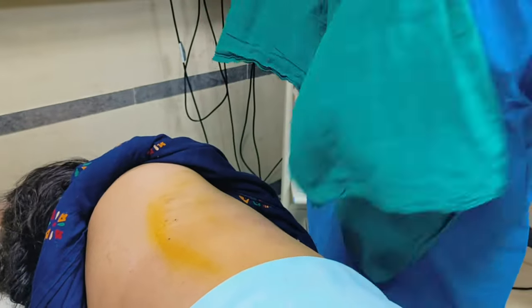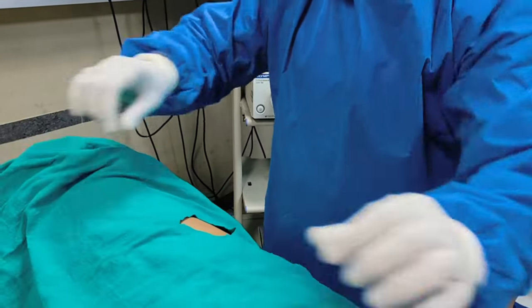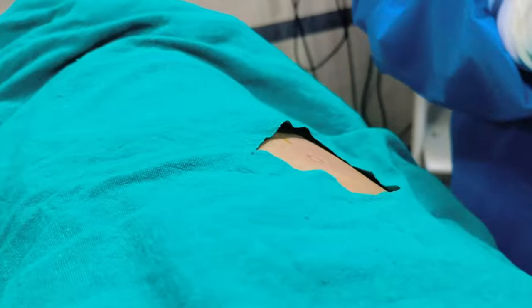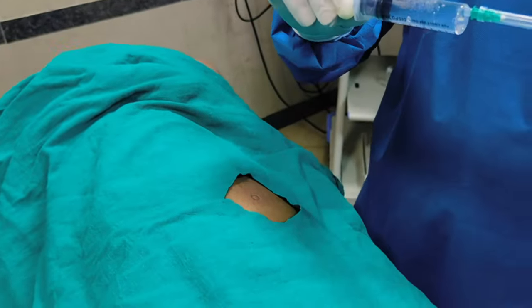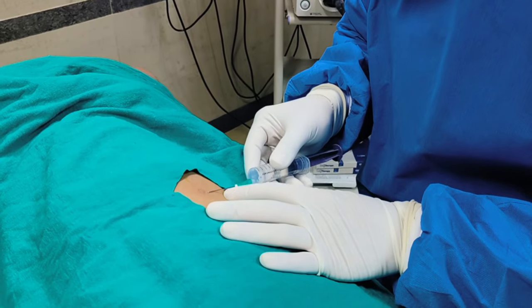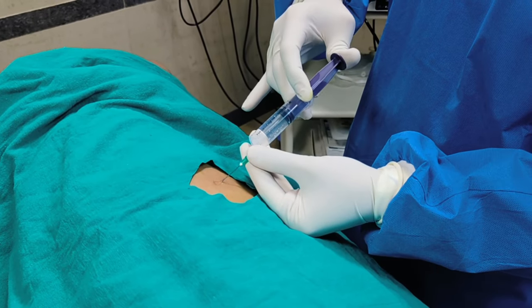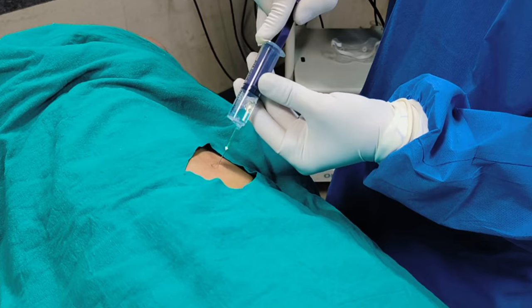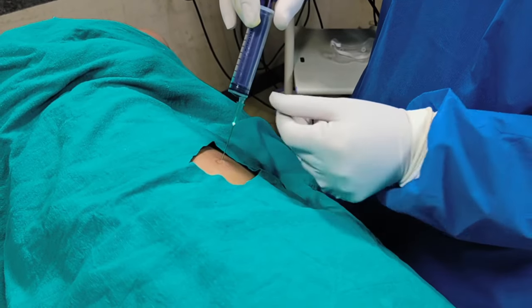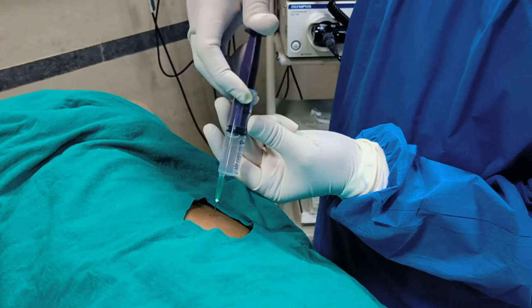Now we will take a cut sheet with a hole in the middle to expose our surgical site only — just to expose the marked site. Now we will give local anesthesia: this is 1% lignocaine mixed with adrenaline. We will give skin infiltration, then subcutaneous tissue, then muscle. We have to give a lot of lignocaine in the pleural area because the parietal pleura is the most sensitive part. In this lady, we are going to give around 20 ml of lignocaine as she is a larger patient.